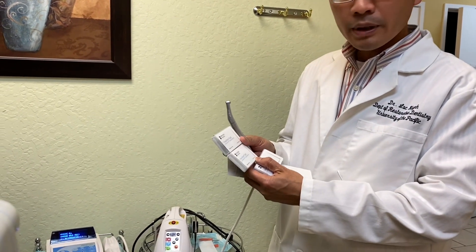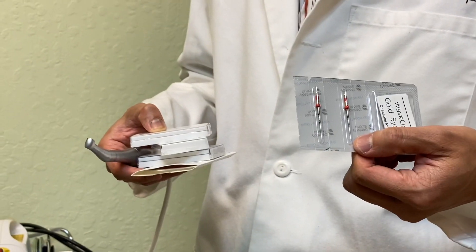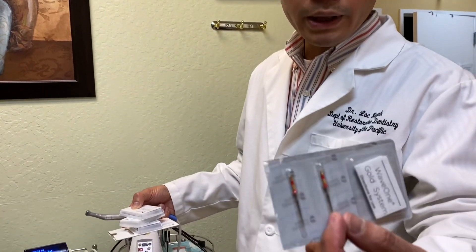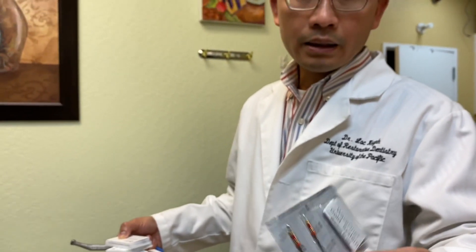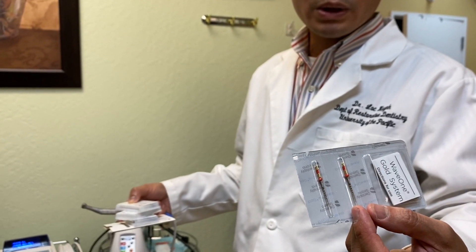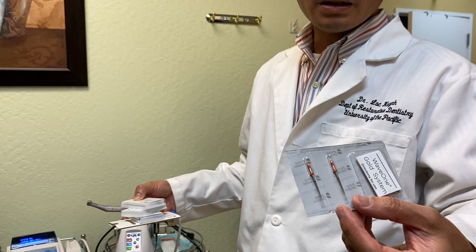The Wave One comes with a few options for the starter purchase: the small size, the primary size, and the medium size. The size I've been using is usually primary. It's so simple — if you just buy the primary starter purchase and the primary rotary file, you can pretty much use it for the majority of your endo cases, especially smaller ones. So the rotary comes in three different sizes: small, medium, and primary. Primary is the one I've been using for most cases.